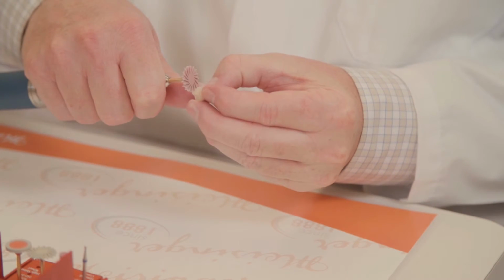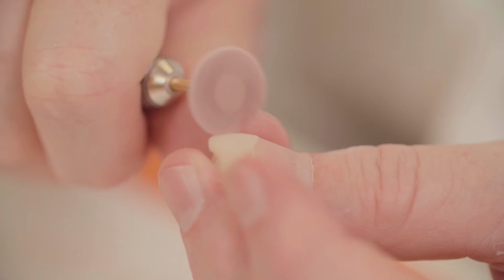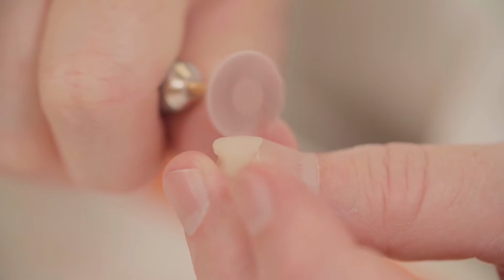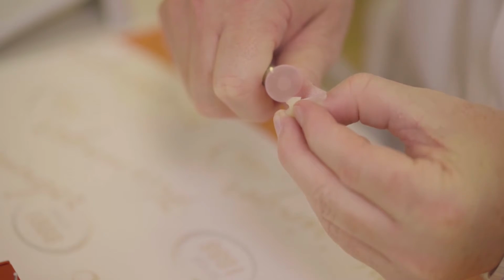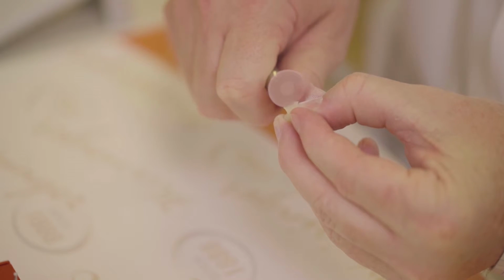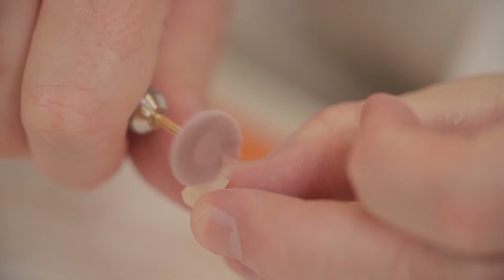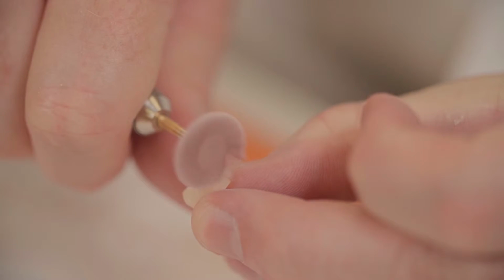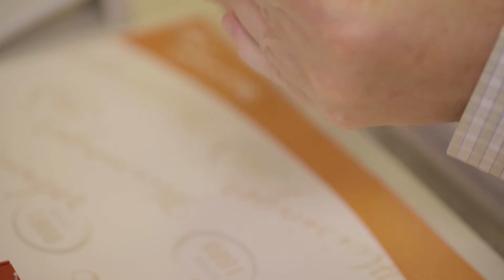You're not going to see a high gloss with this pre-polish, but I want to caution you on that. It's going to look very matted, and that's exactly what we're looking for here, a matted finish. So I'm going down towards the margin. Keep in mind with the twist, you're going to protect the margin with your thumb, with your nail, and you're going to come down into that. Once I've got this exactly where I want it, we're going to go ahead and stop. So that should just take a few seconds to do.